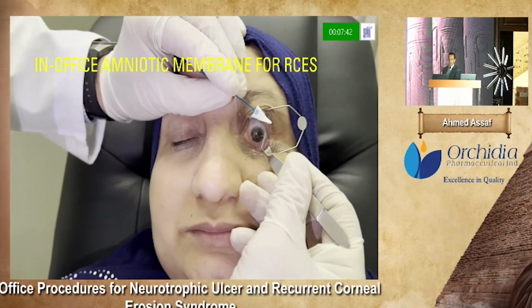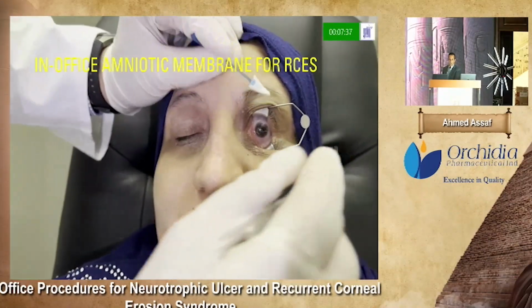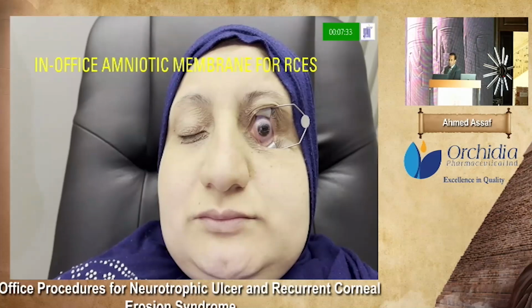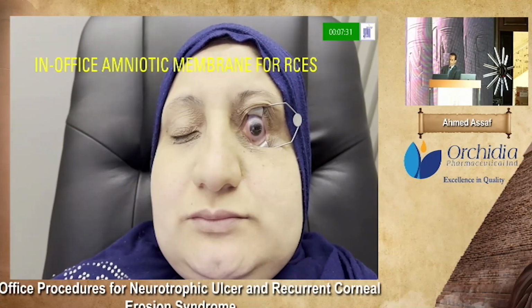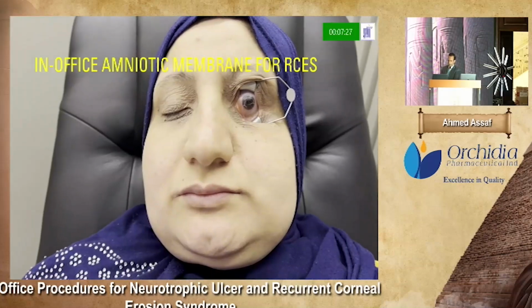So it's a simple in-office procedure that you can apply in cases of recurrent corneal erosion syndrome after failure of medical treatment, or recurrence of the symptoms when the patient is not satisfied, or when the symptoms affect the quality of life for those patients.